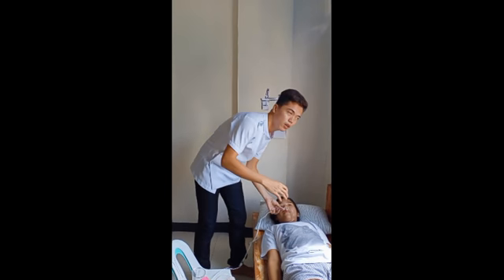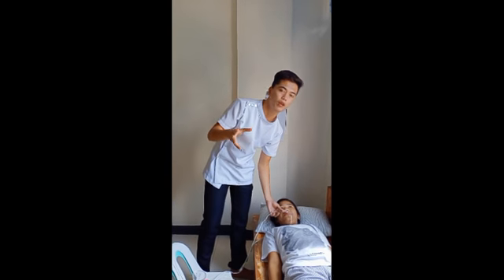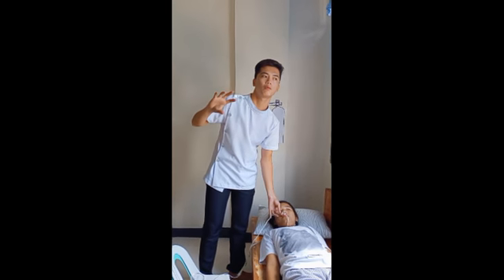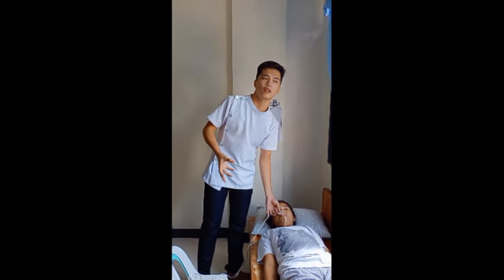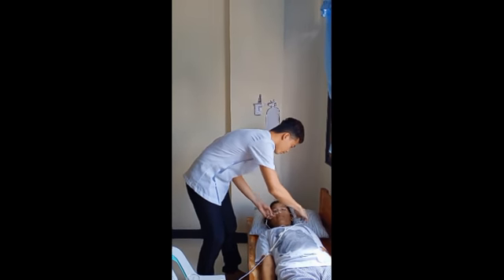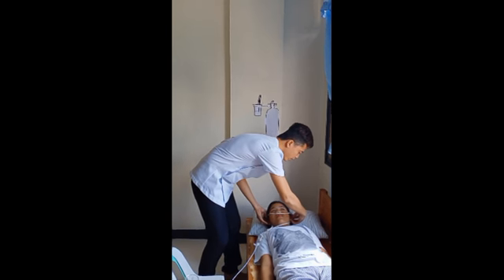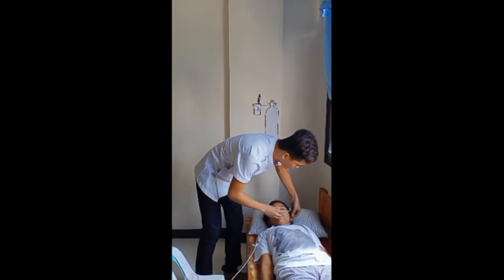So if you can see, I'm using this to lock the nasal cannula in the ear, to easily put the nasal cannula on the patient. So I'm going to put the nasal cannula here.